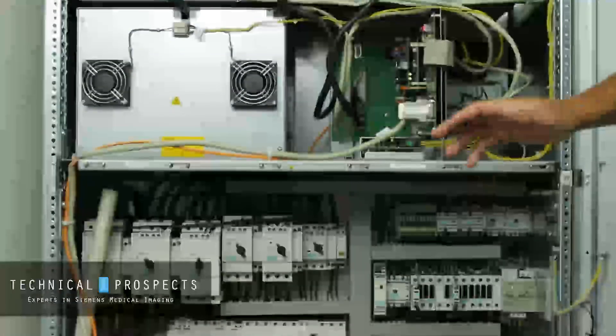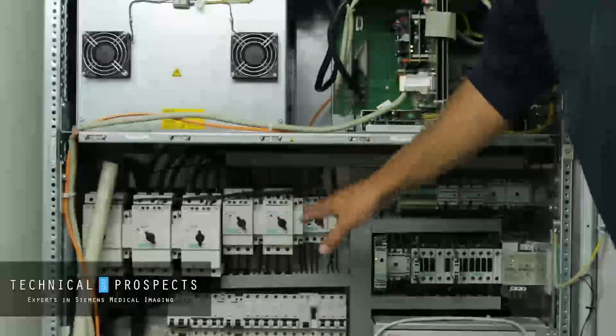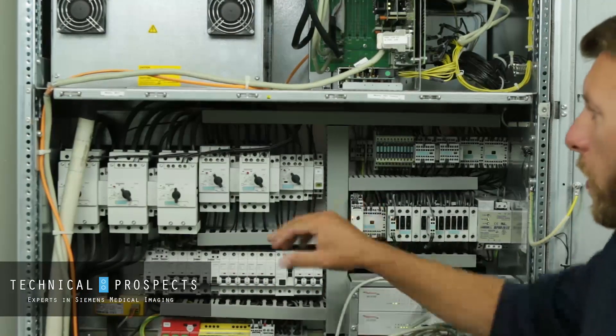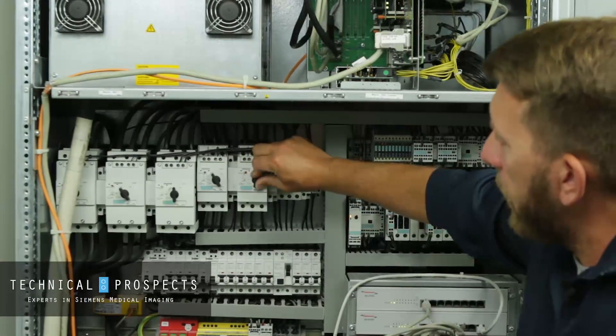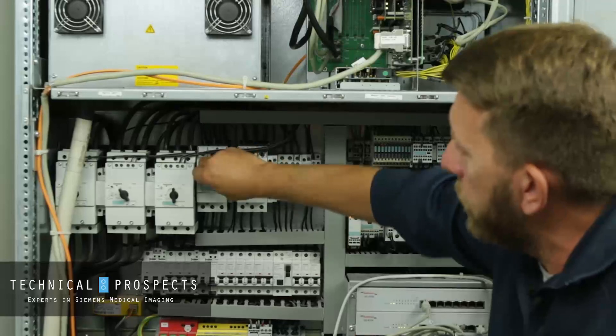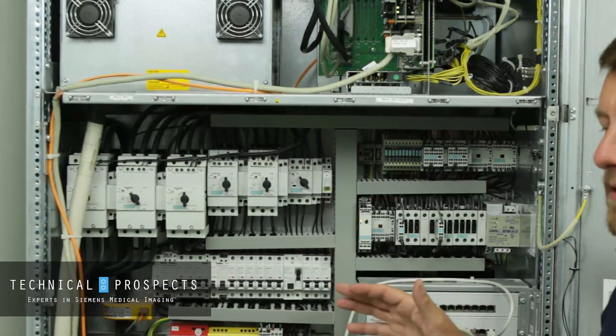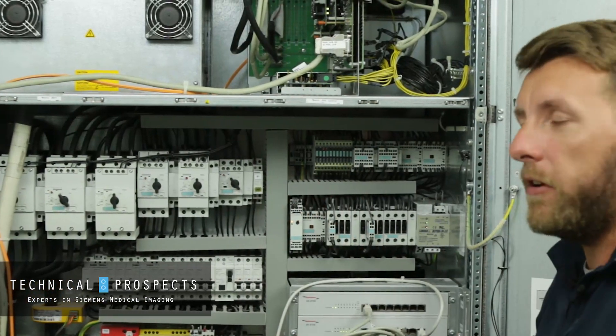Also remember that on the lower part where we shut the S1 switch off, once the service is complete, in order to restore power you need to reset these breakers first before you can do that. Once you reset them, then you can reset the power back on — otherwise the power will not come on without resetting the breakers.